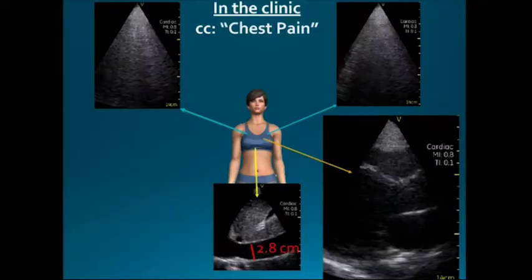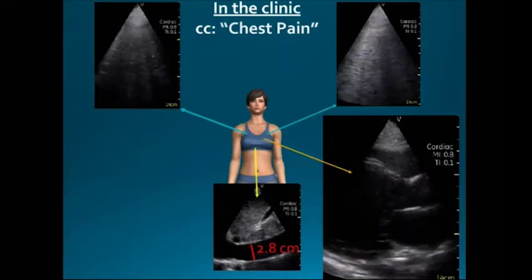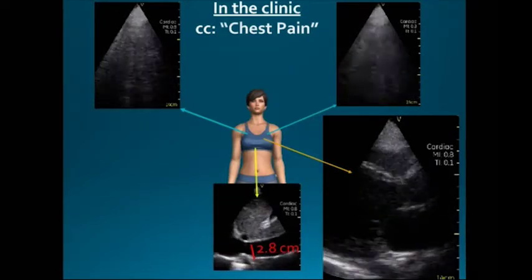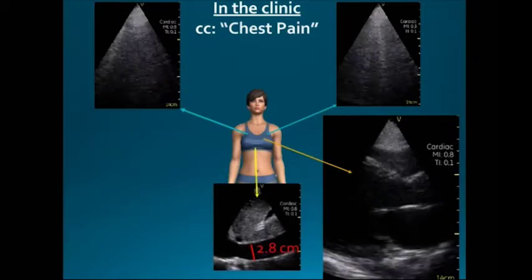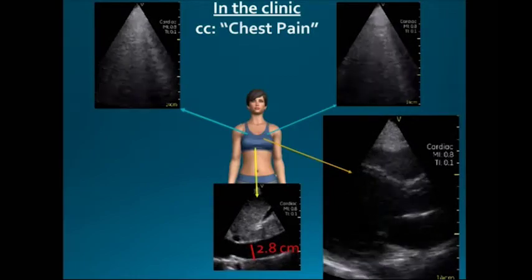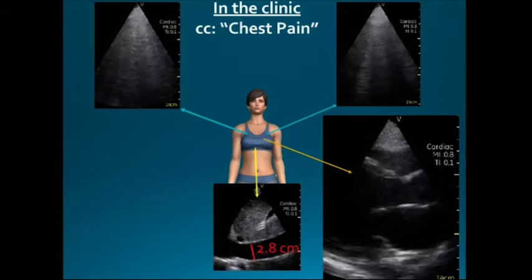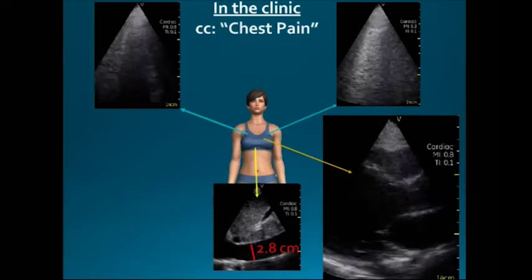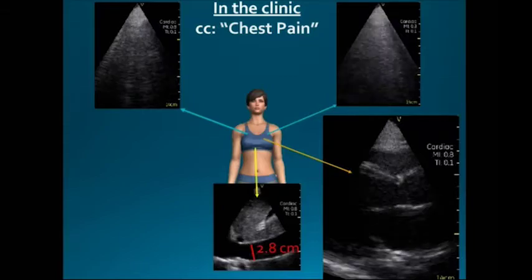How about in the clinic? This patient of mine came into the clinic complaining of chest pain. She had been in a motor vehicle accident a few days or weeks before. She was complaining of very pleuritic chest pain and cough. It was a very confusing history. She was all over the map, thinking she had sinusitis and it had gotten into her chest, but I was thinking, oh man, I hope she doesn't have a pneumothorax. She ended up having an ultrasound of her lungs that looked something like this.